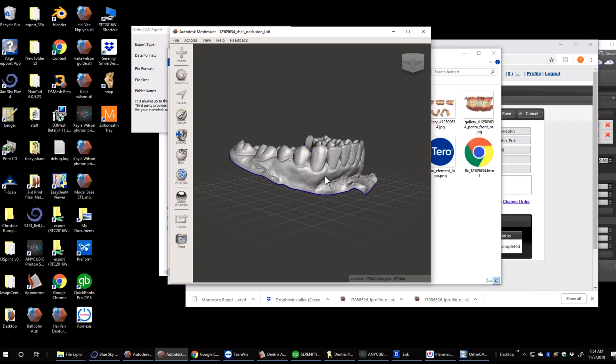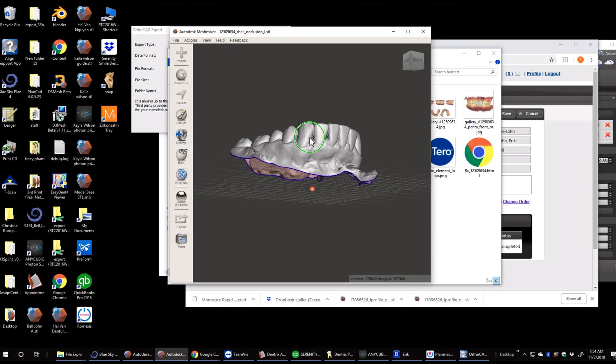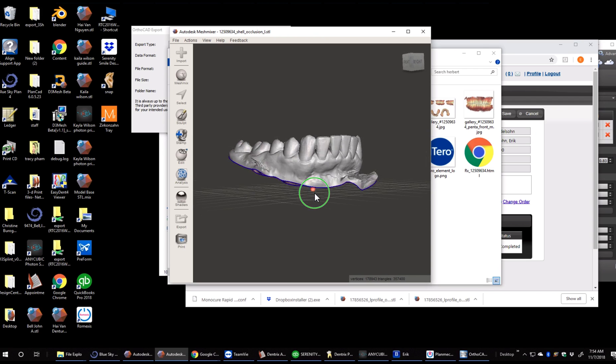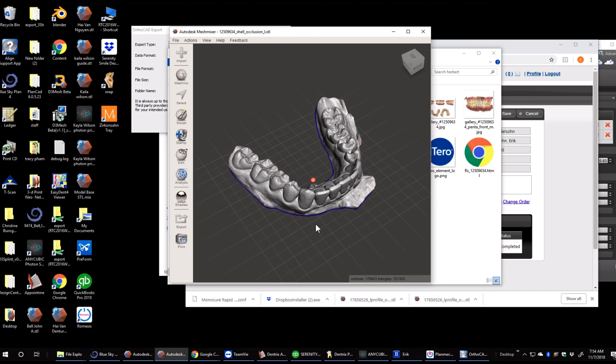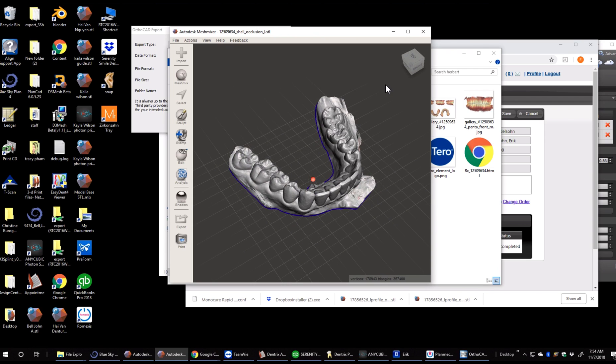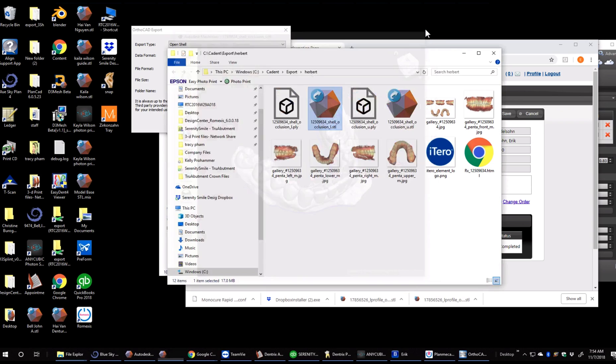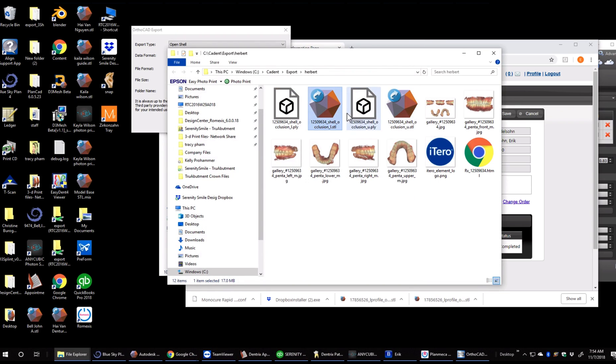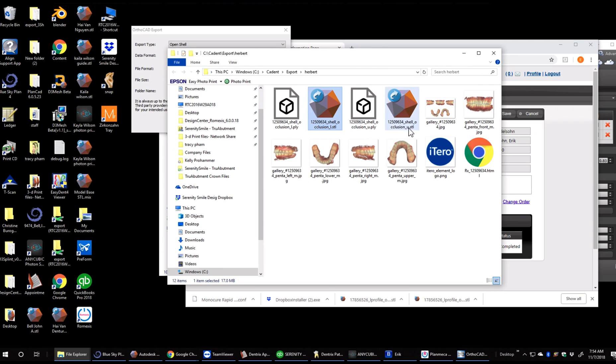And you can see here is where we would clean up the model, get it ready to print, or put it into another software if we need to. So I'm going to close that up and just let you know that this shell is the format we picked. This little L is for lower. This little U is for upper.